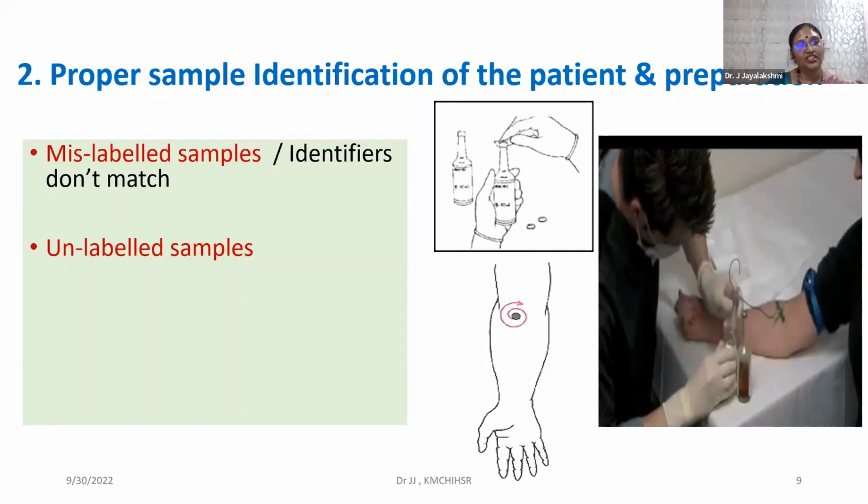Sometimes if it is a precious sample, it's going to be very difficult. Timing of samples is so important. Sometimes we carefully time the sample and collect it, and it becomes a waste when you can't use that particular sample at all. So you will have to have your sample labeling done appropriately and match it with the test request form.